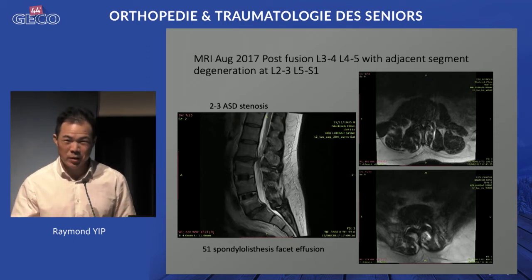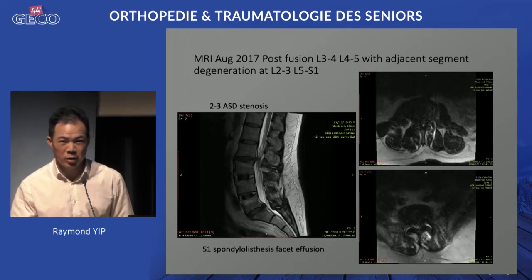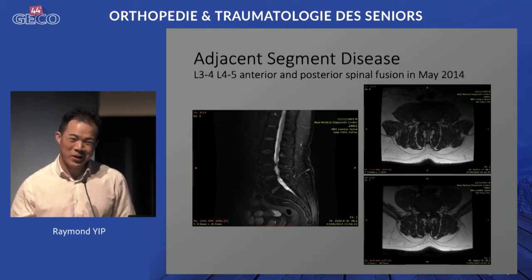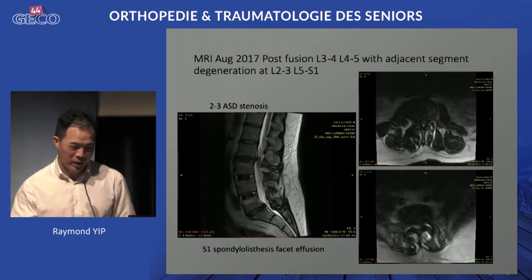However, he's developed ASD, adjacent segment degeneration, proximally and distally, so above and below the fusion. There's new DDD. If you go back, you look at the discs before, above and below, they were quite normal, and this is only in the space of 3 years. So is this a natural phenomenon, or is it actually provoked by the fusion? And the fusion surgeons will tell you this is not the case. We don't have adjacent segment disease, but I believe otherwise. So the interest in lumbar disc replacement came about because of the need to try and preserve mobility of the spine.